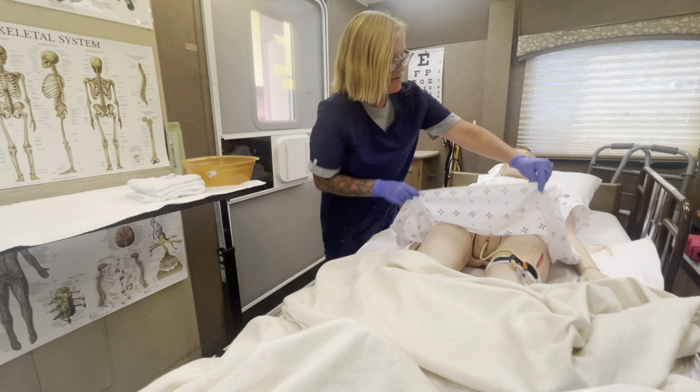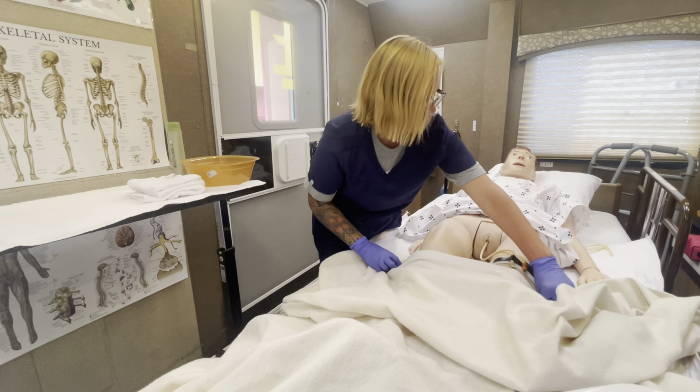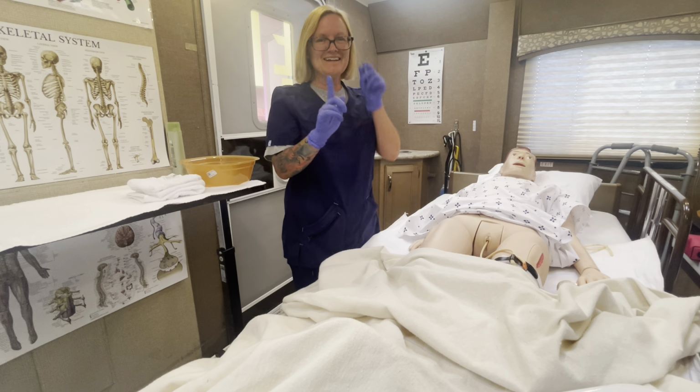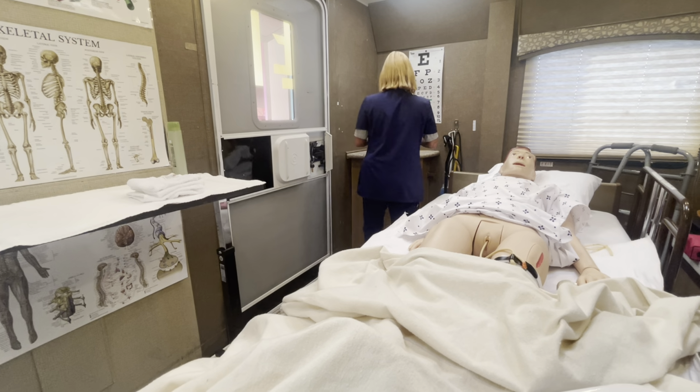Then I'm going to lift up the gown to expose the area of the catheter. I know that I have to wash at least 4 inches, right? Okay, that's going to be important. Next thing I'm going to do is get my water.